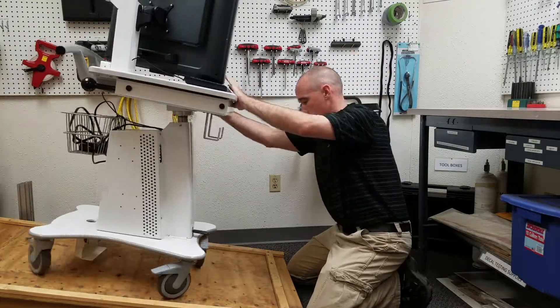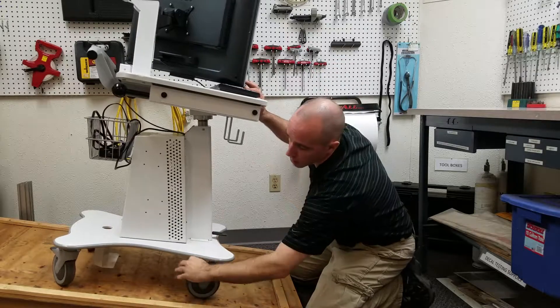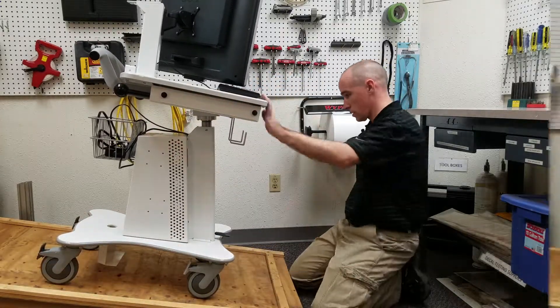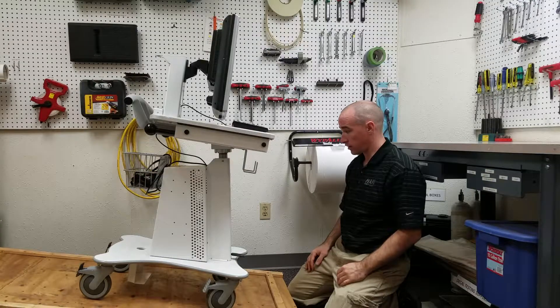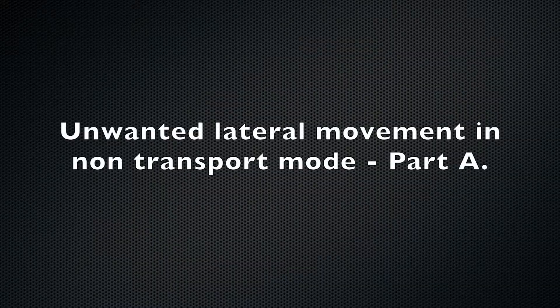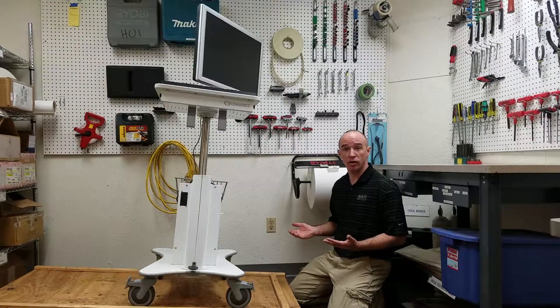This cart passes — there's no sliding at 10 degrees. Now we have our cart ready for the non-transport mode test.